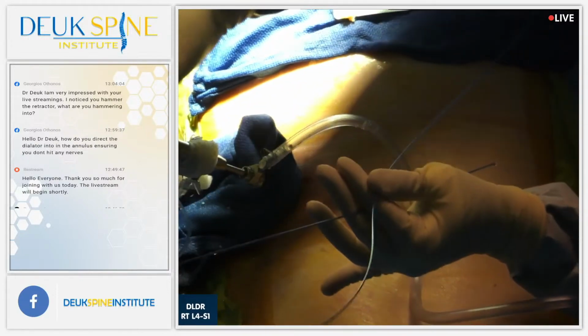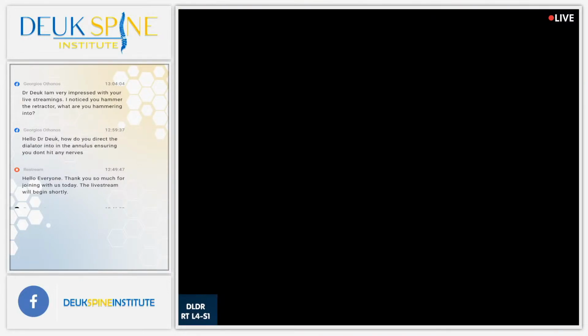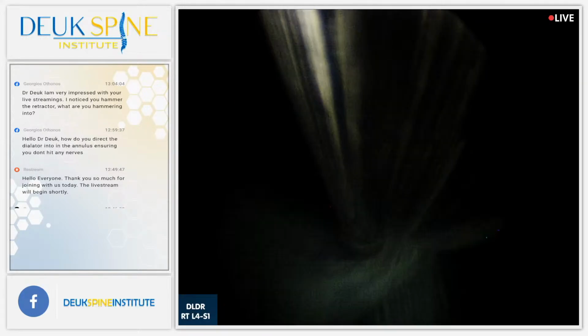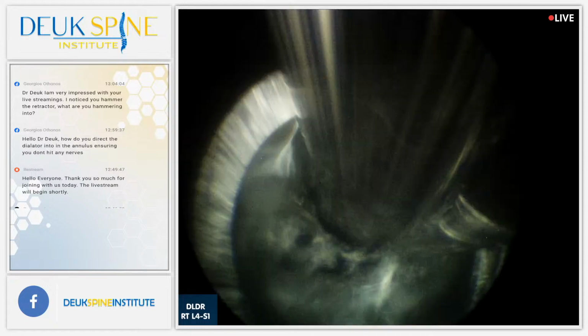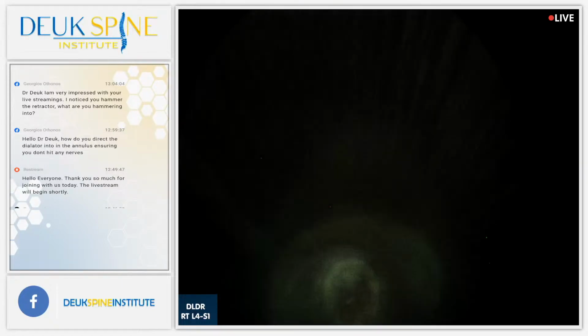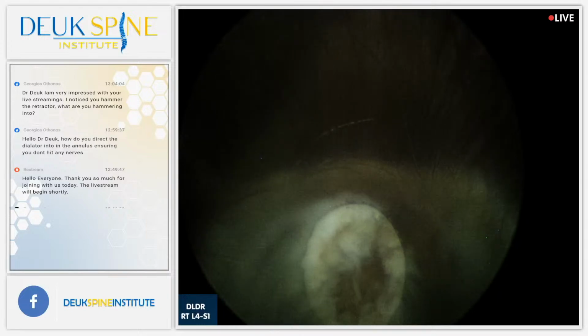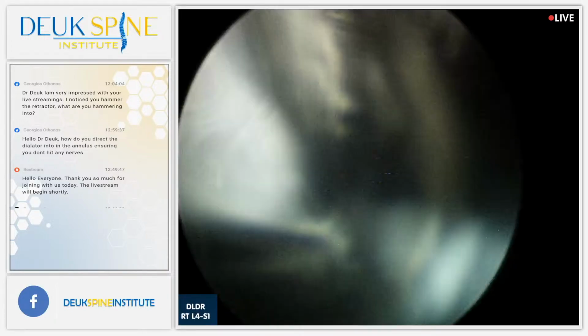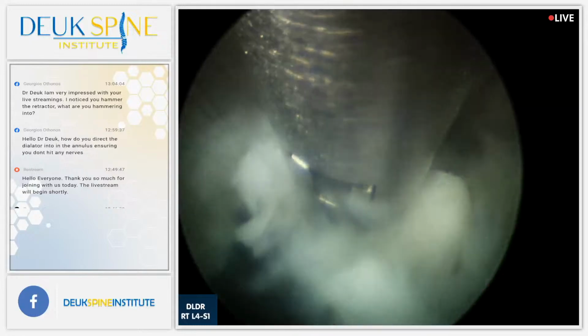Wow. I don't know that we're done. All right. Again, more pieces. So people think that a herniated disc is a herniated disc. It's one herniation, but it's not. It's actually many pieces, usually in my estimate around 30 pieces of herniation.